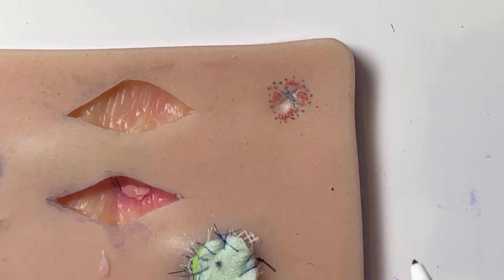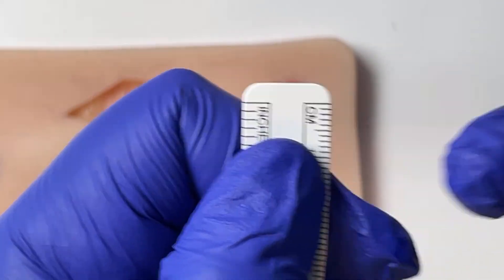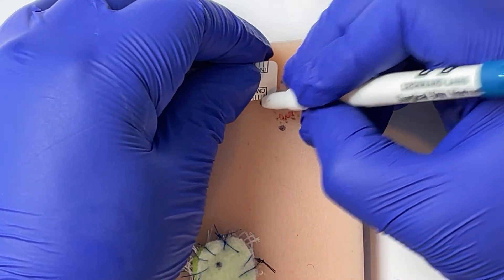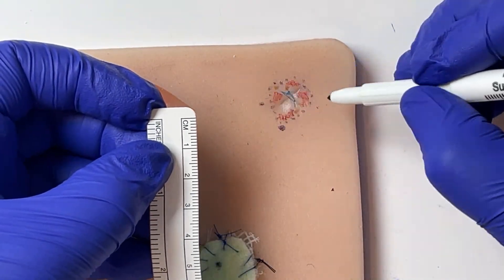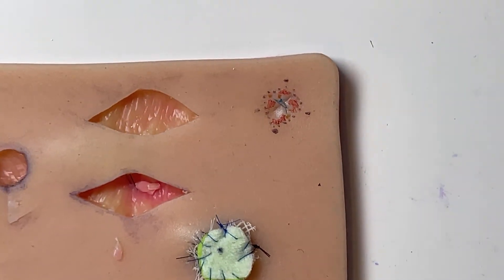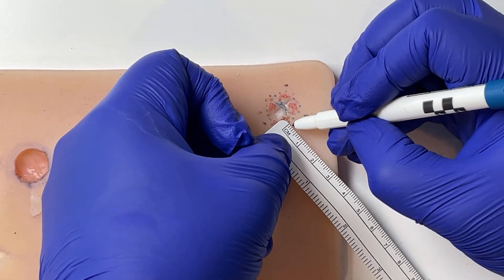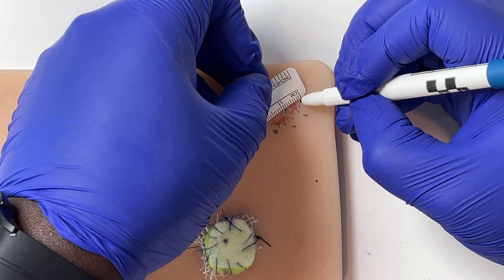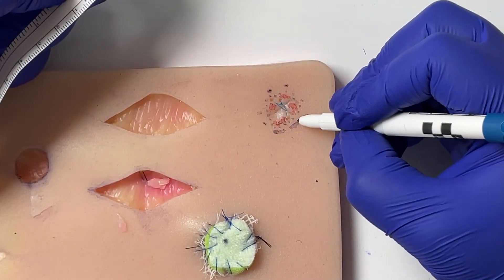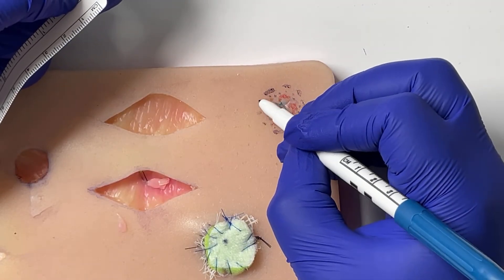If it's diagnostic, we're going to do a one to two millimeter margin. Get your ruler and I typically do two millimeters. I mark my positions at 12, 6, 9, and 3, and then if it's asymmetrical I'll add a mark somewhere in between where it might be slightly narrower. It becomes circular-ish — not a perfect circle — and then I'll just do dashed lines to join up the area. This is all before you put your local anaesthetic in.